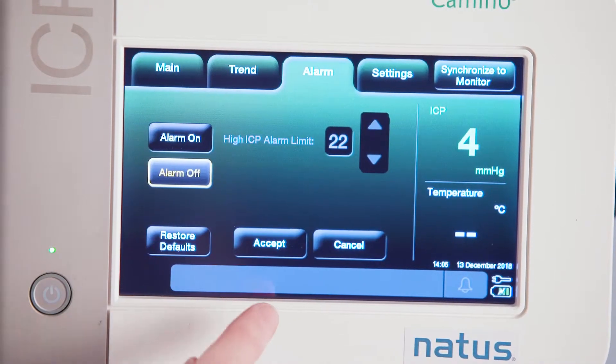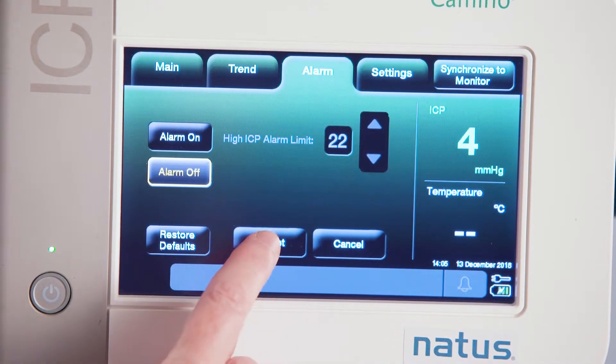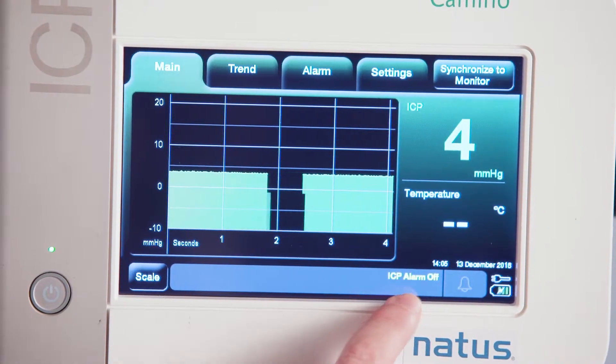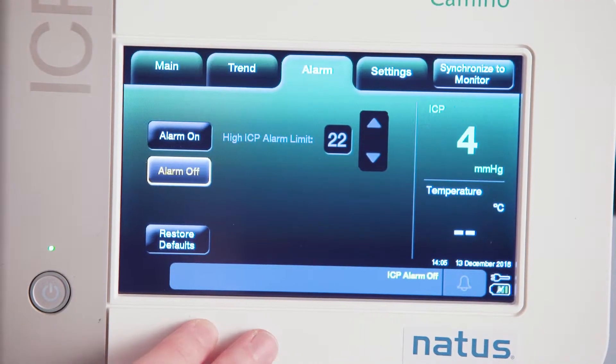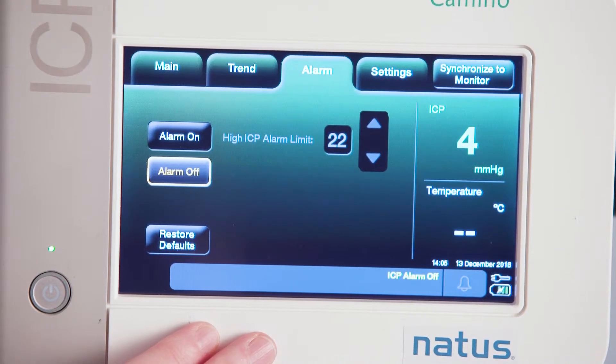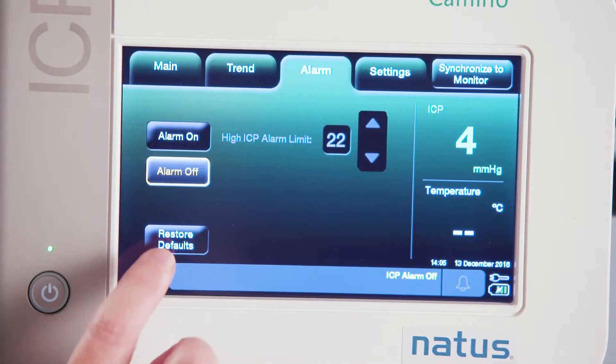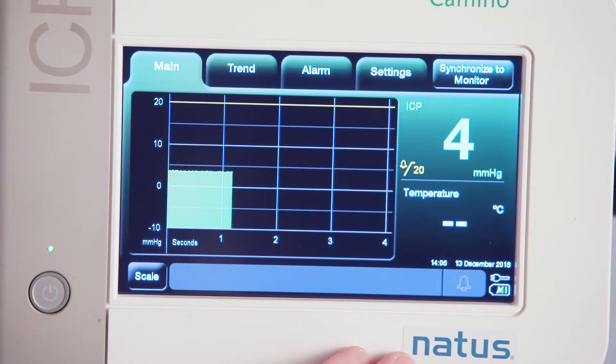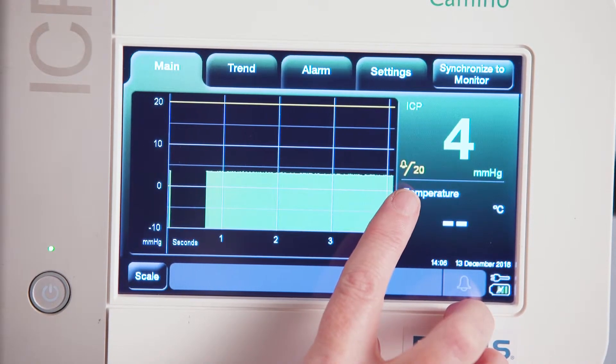I can also go under my alarm screen and turn my alarms off. To do that, I simply touch the button that says alarm off and hit accept. My bell goes away on my main screen and now I have a message down here in yellow telling me that my ICP alarms are off. But I want to turn them back on, so I'm going to go back under alarms and restore the default. The default setting is currently at 20 millimeters of mercury, so I'll touch restore default, hit accept, and now my ICP alarm is set back at 20.